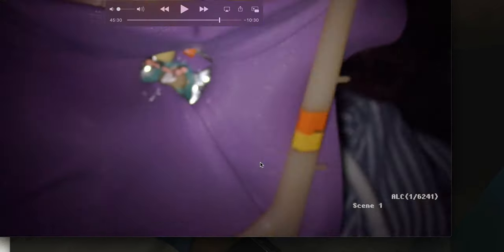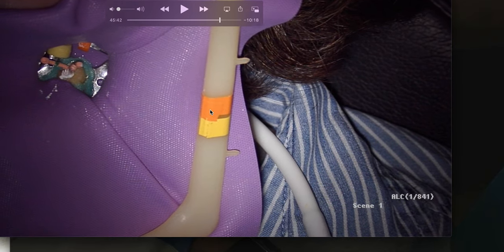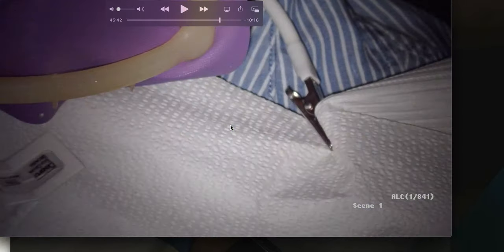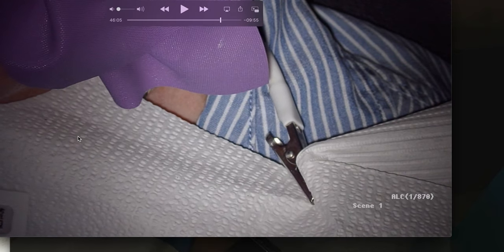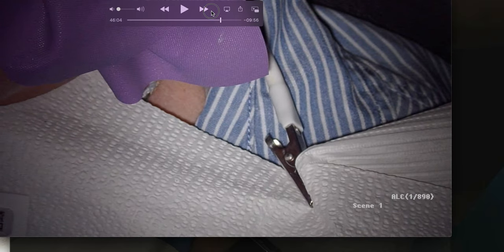Now we're going to take an X-ray. I'm trying to get this in the microscope view as best as possible — taking the rubber dam frame off. My dental assistant marks the rubber dam with a hole to indicate the lower right corner, so after you make a mess with it you can realign it properly. The tear I normally do also automatically goes to the patient's right when I take the frame off. I've been doing that for about 8 years — it works amazingly well because a lot of time is wasted trying to figure out how to put the rubber dam back on. Now putting the sensor in.